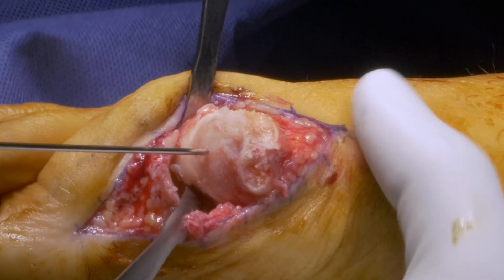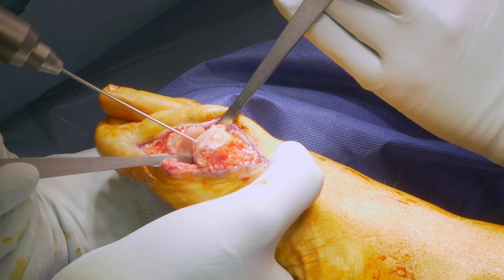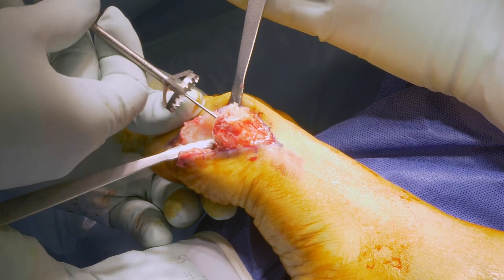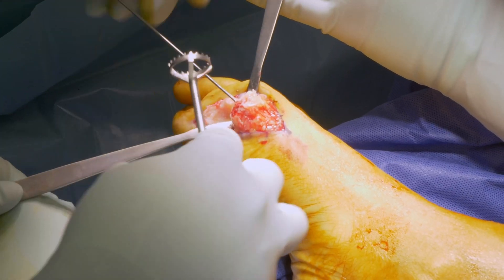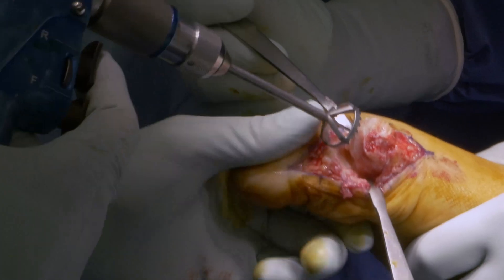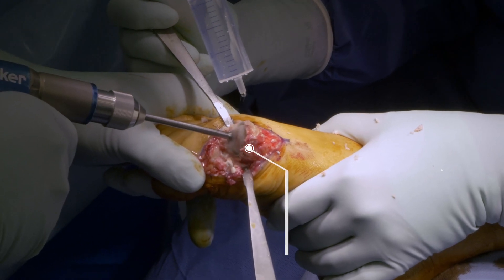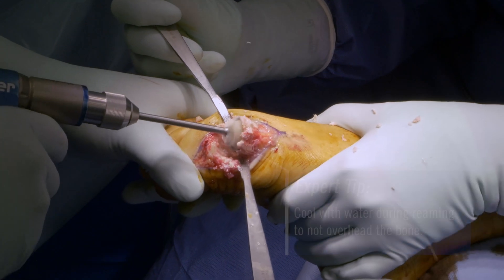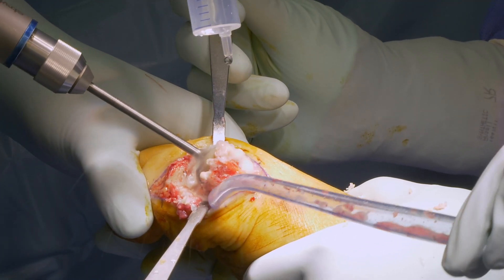A 1.6 mm K-wire is inserted centrally in the direction of the first metatarsal shaft up to the diaphysis. The size of the reamer is determined — in this case, we use a 20 mm cone reamer. The reamer is inserted over the K-wire to remove all cartilage and sclerotic bone. Cool during reaming with water to avoid overheating the bone, and do not apply too much pressure to avoid loss of control and excessive shortening.